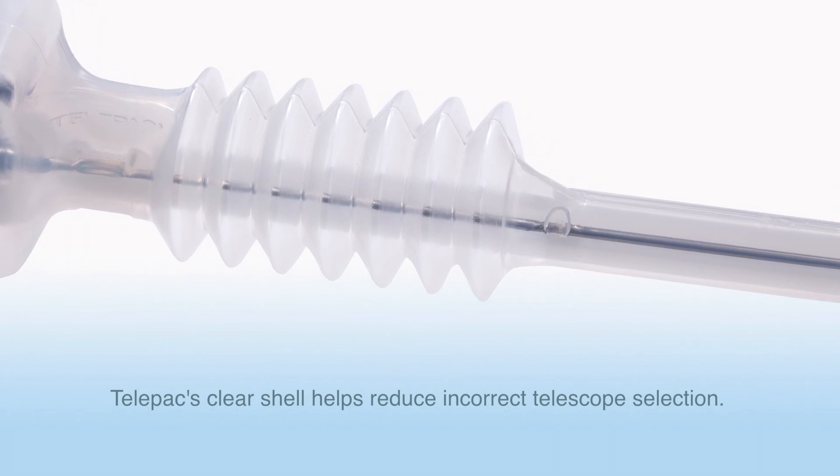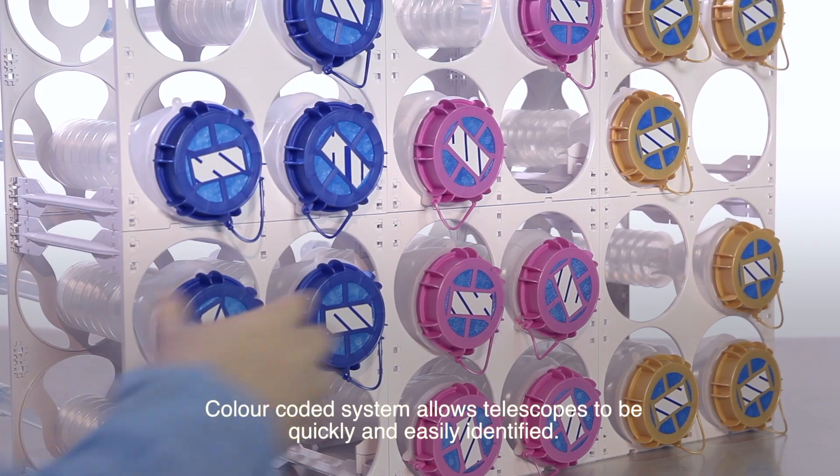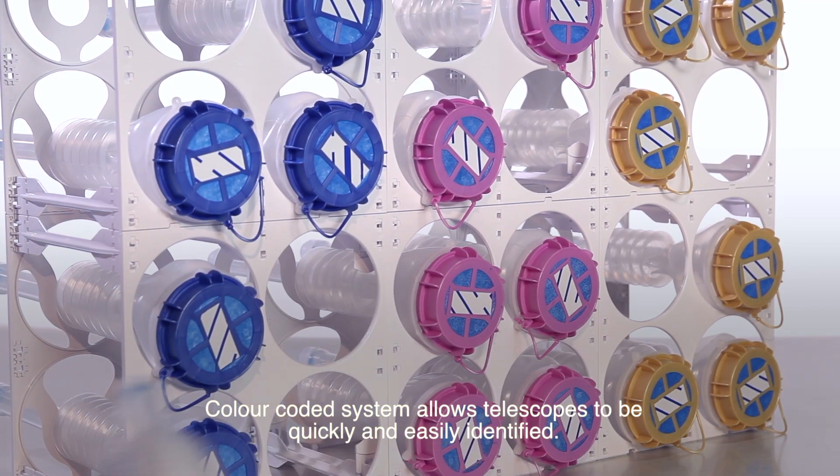Telepack's clear shell helps reduce incorrect telescope selection. Colour-coded system allows telescopes to be quickly and easily identified.